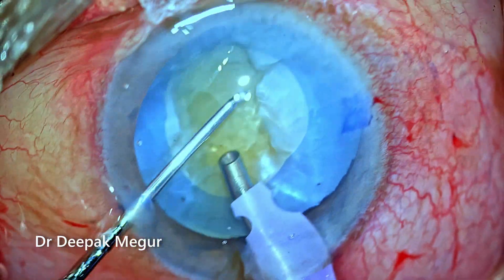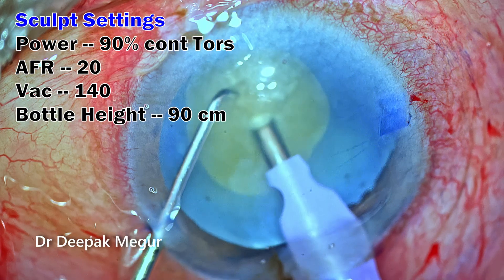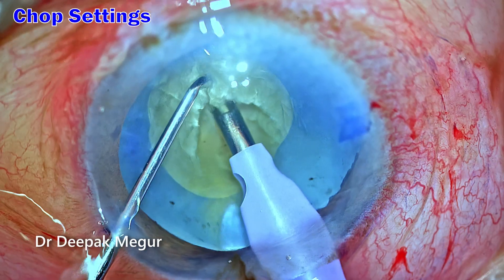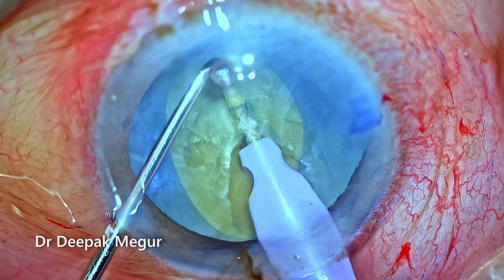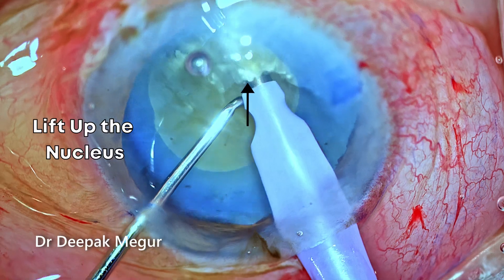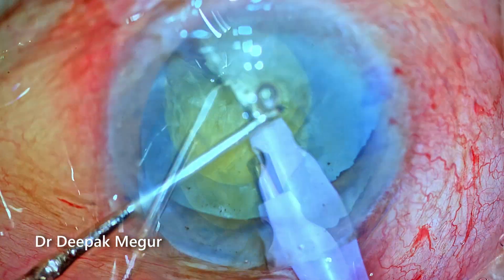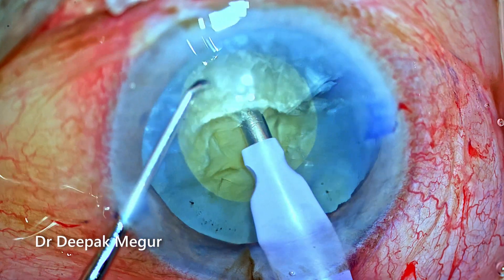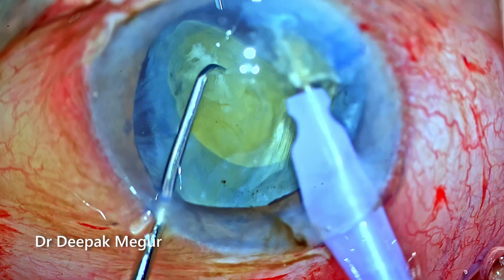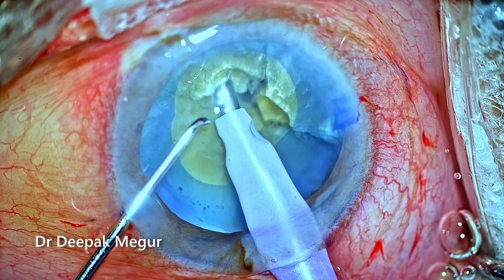Time to deal with the nucleus. The nucleus will be slightly mobile and has some density — it's not very soft. My standard technique with a torsional ultrasound machine is to sculpt the nucleus a little so I can bury the thin tip into as deep a core as possible and then perform vertical chop. During nucleus division, I take extreme care to lift the nucleus when my second instrument is chopping, to minimize any stress on the posterior capsule or bag during chopping and lateral separation maneuvers. These eyes have extremely flimsy capsules and are always vulnerable to tearing.